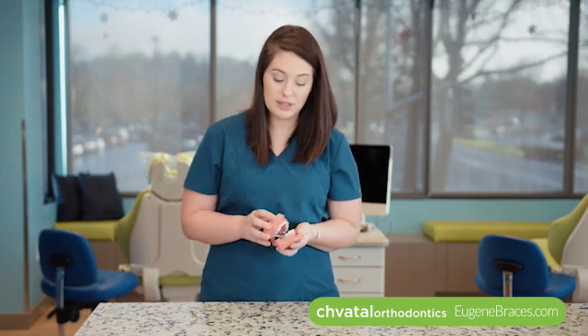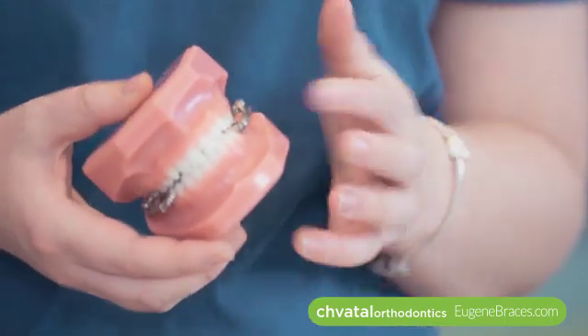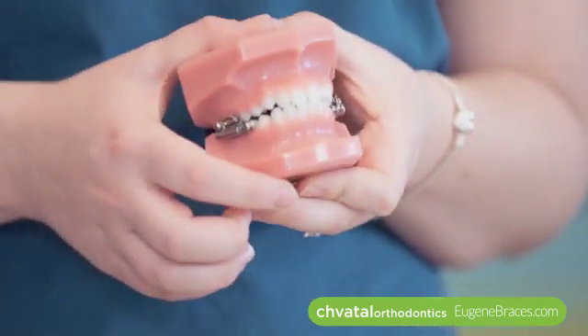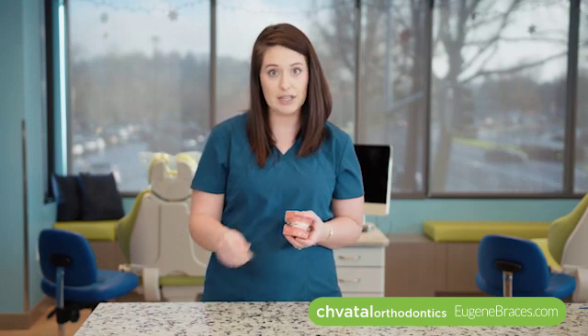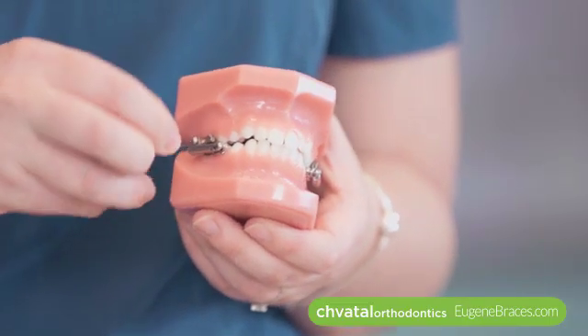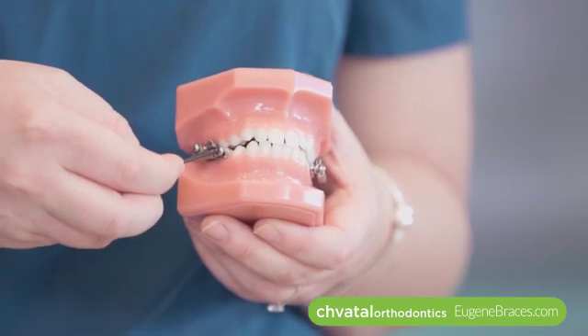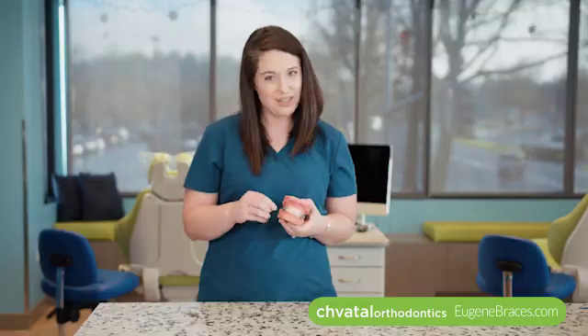The next thing I want to talk about are the screws. The screws are what hold the arms onto the bands. Sometimes these screws can get loose — as we talk, we work in a circular motion and it can back that screw out. At your appointments we'll make sure they're nice and tight, but at home if they start to feel loose, you can grab a small allen wrench, insert it into the screw, and just turn it until it feels snug. You don't need to give it a hard twist — just until it feels snug, then straight out and you're good to go.